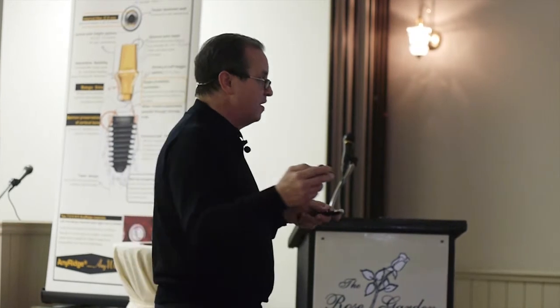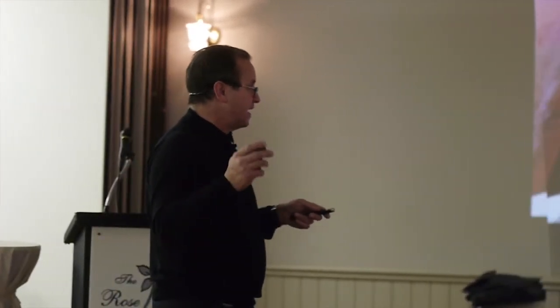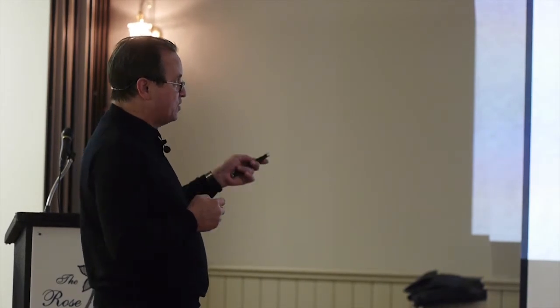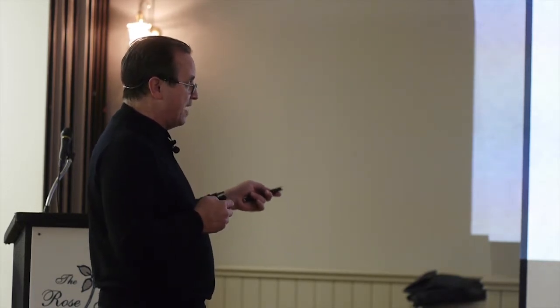So we've got good initial fixation here, really good here, but I just wanted to cover all this up and let it sleep, and I'm going to use this to stabilize the provisional bridge. We're going to wind up taking this out later, okay? But we're just using it to stabilize the provisional because I don't want to put him in a flipper. I don't want him to wear an Essix appliance because I know he's going to hate it. So we've got a preliminary impression, put our PEEK abutment in, put this little thing on the O-ring, O-ball, and went in the lab and used flowable resin to create the emergence profile.